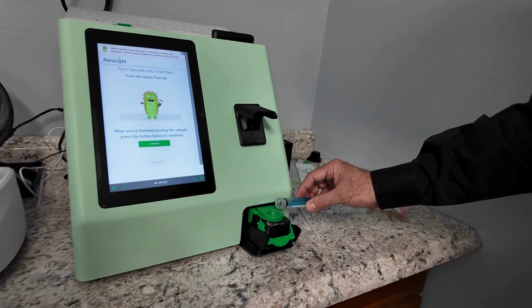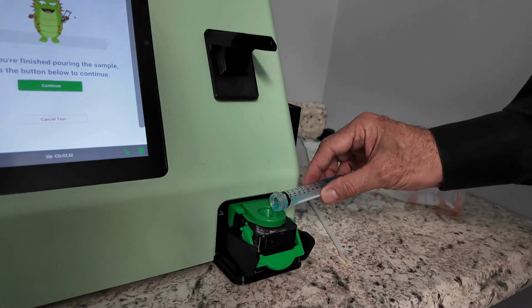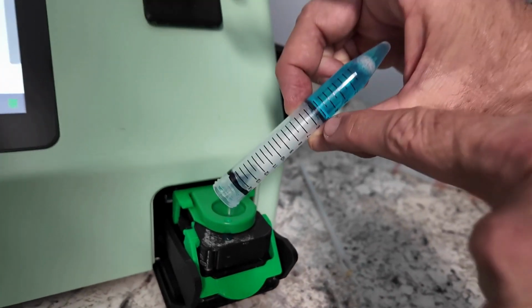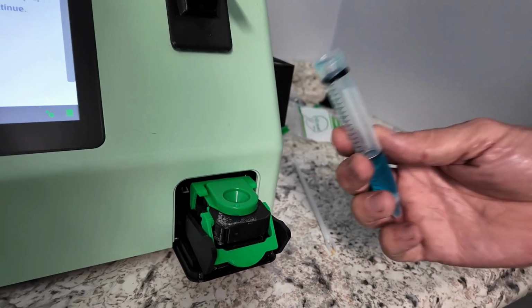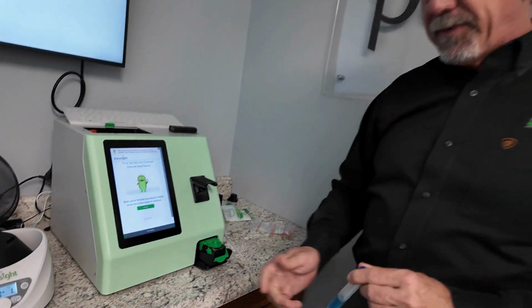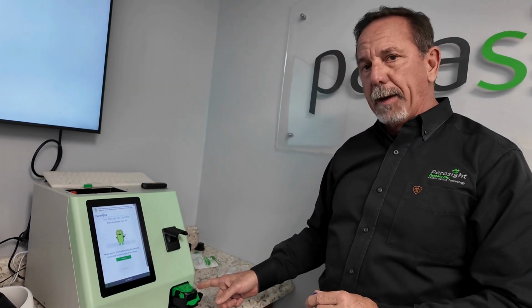Now you'll notice again when I pour this in, because I put the egg separator in, you can hear it working, but notice it does not pour in everything. This means that you'll have a clean sample, and it's very, very unlikely that that will plug up at this point.